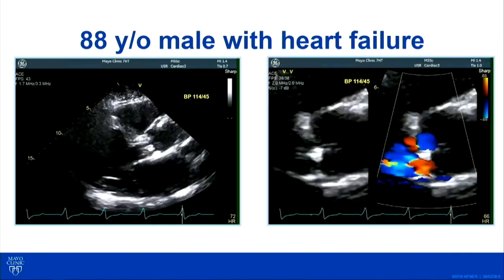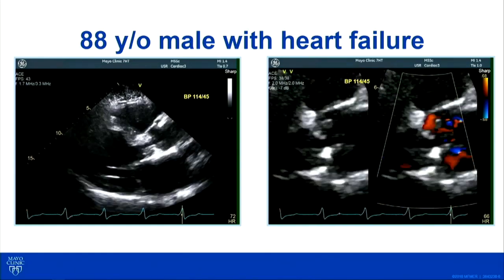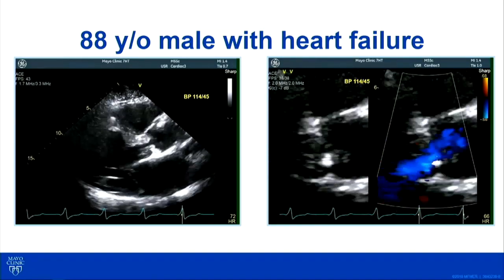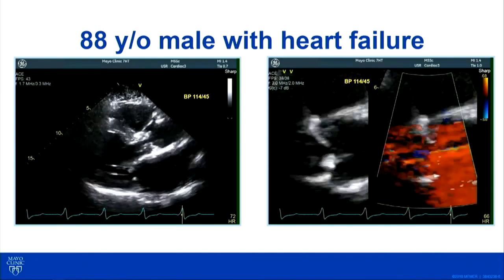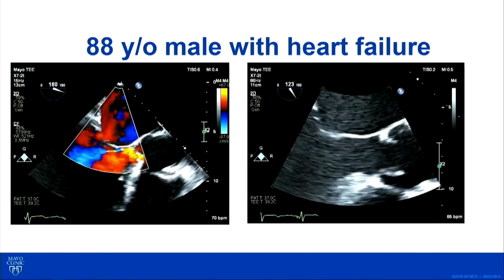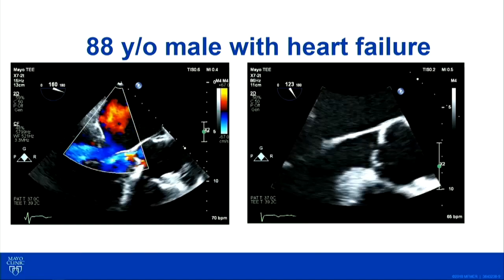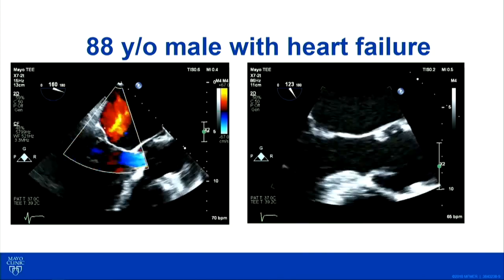This was an 88-year-old man with heart failure, and he had an echo after not having one for many years, and was found to have LV enlargement and a reduced EF of 30%. He also had aortic regurgitation. You can see he had sclerotic leaflets that were not severely calcified. And this is his TEE. You can see significant aortic regurgitation hitting the base of the anterior leaflet. There were some degenerative strands on the aortic valve, so he underwent a workup for endocarditis, and that was negative. So these were thought to be degenerative changes of the leaflets.